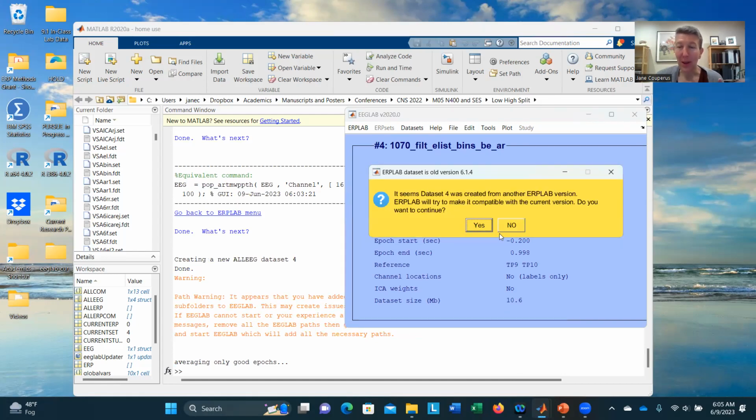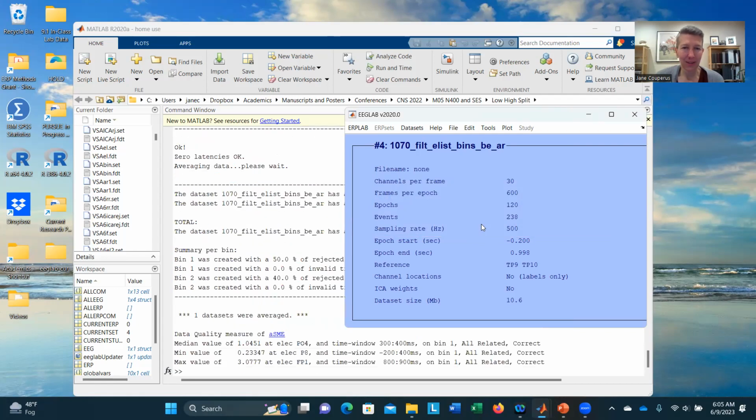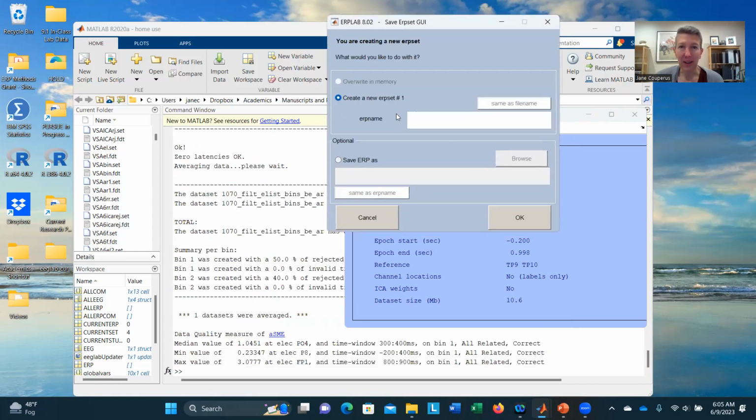Don't worry about this if you happen to be using different versions. I happen to be using a different version than when this data set was created, so that's fine. And it's doing stuff. And now it's going to ask you to create a new ERP set 1. Now, this is a little bit different, and I'm going to call this 1070. I'm going to say moving av. So this is just so I know that this is the one with the moving average peak to peak.